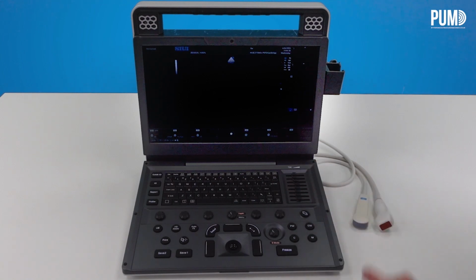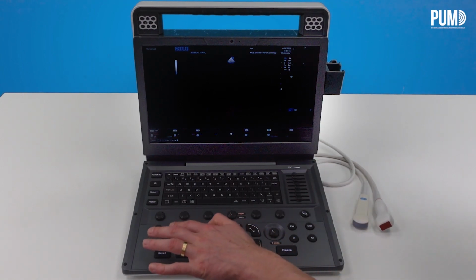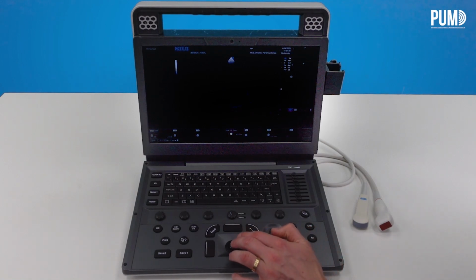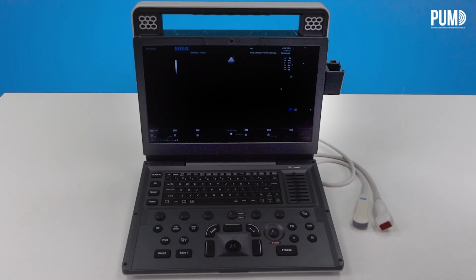You do have TDI here. You do have a zoom button, so I can hit the HD zoom. That will bring up your box, and similar to the colour box, tracker pad will adjust position. I can click in to adjust size. And when you want to enter the zoom, just hit that top button there, and that will bring you in to your zoom box.